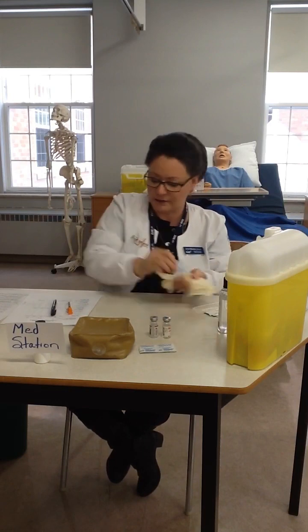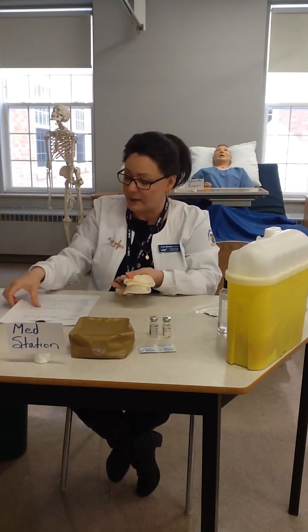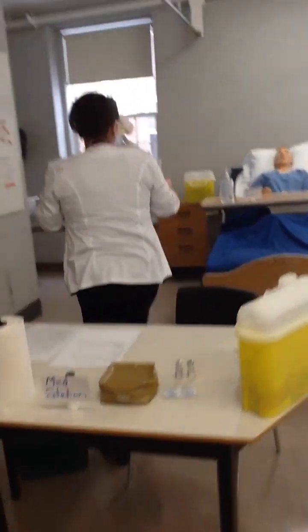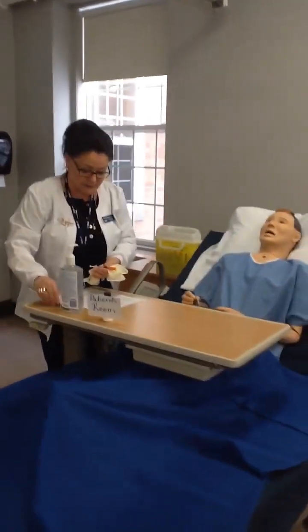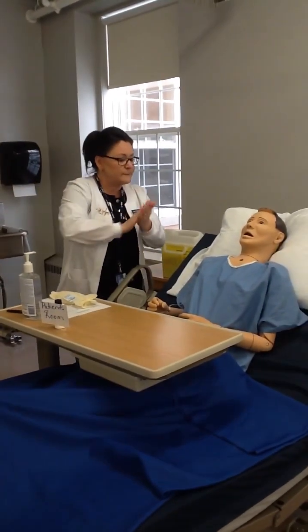And I'm going to take an alcohol swab, my syringe, my pen, my MAR, and I'm going to head to my patient's room. And as I enter my patient's room, I'm going to close the door. I'm going to pull the curtain. I'm going to set my stuff down, and I'm going to do hand hygiene in front of my patient.